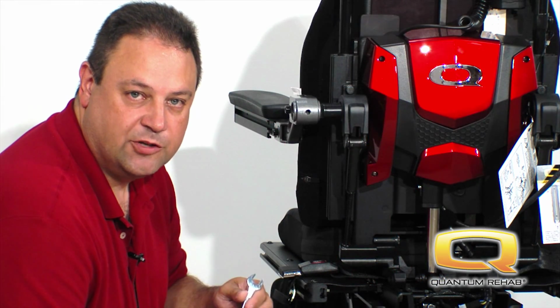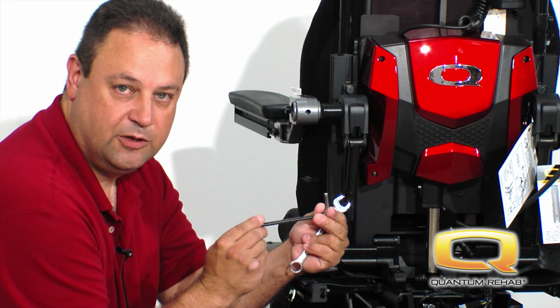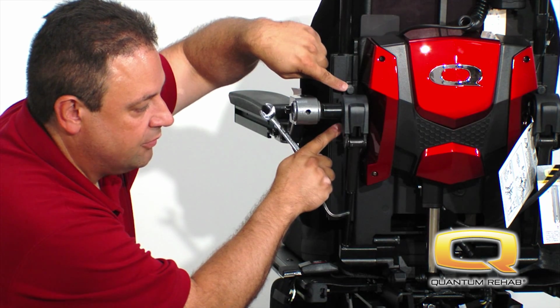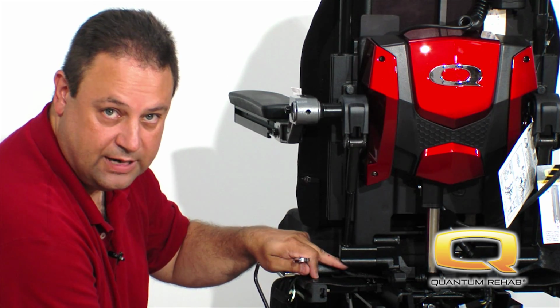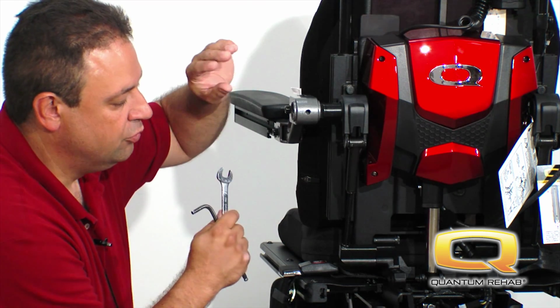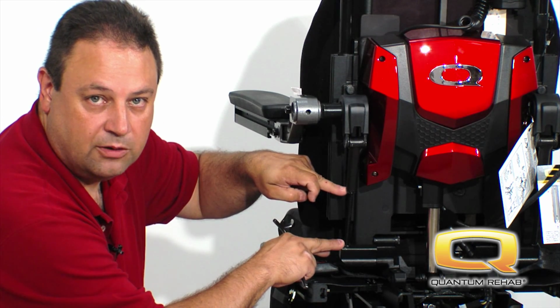To do arm height adjustment, two tools are required, a 13mm box wrench and a 6mm Allen key. The 13mm box wrench is used for the two bolts located right here, the two bolts located right here, and the Allen key is used for the head of the bolt down here. To do arm height adjustment, it is imperative that you do two locations, both here at the pillow block assembly and here on the turnbuckle.